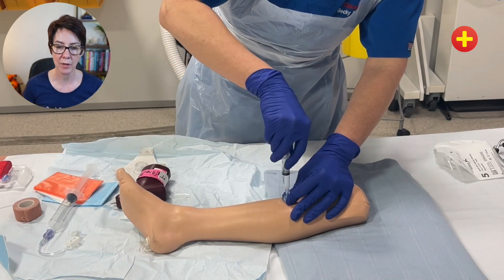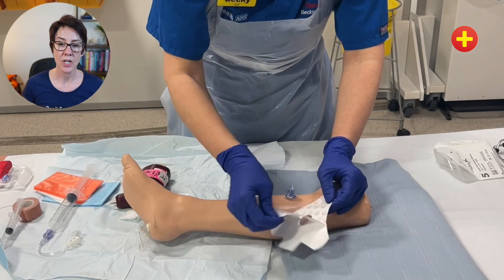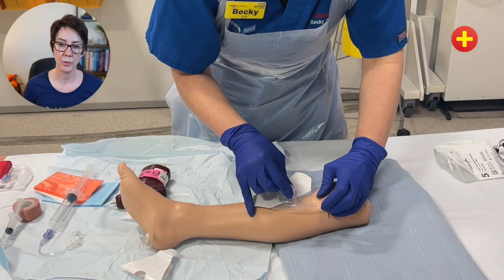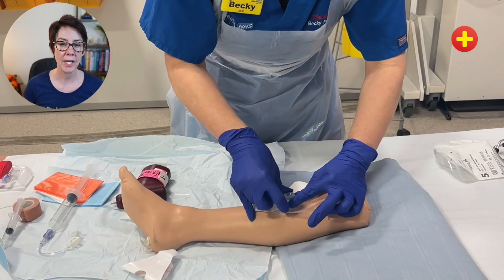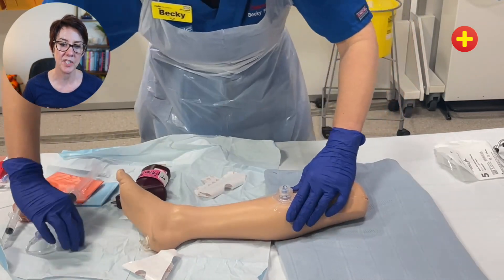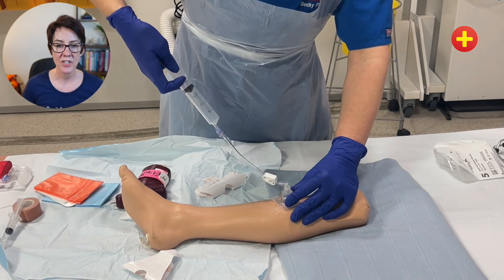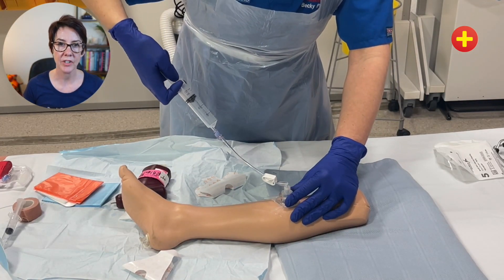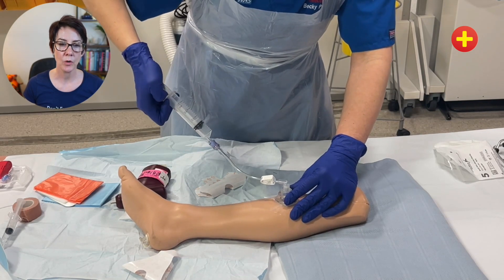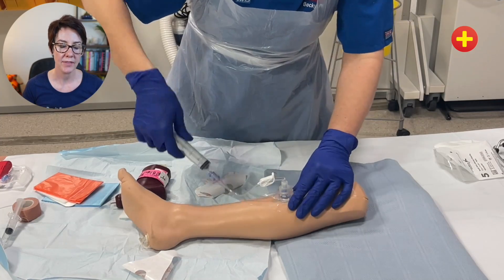You can aspirate at that point and then apply the dressing. Note that the needle is standing up on its own without support. In the tibia, put the dressing with the curved part just under the knee and the pointy part of the triangle down the leg because it fits a bit better, then attach the extension and give a good firm flush. It's going to feel quite stiff at first as you break up all that intraosseous mesh — that's okay.